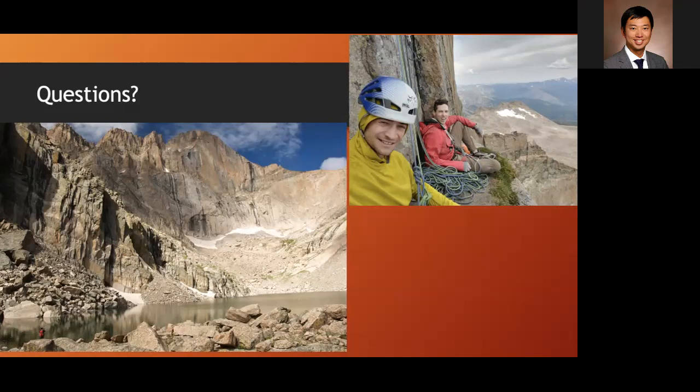And then great talk, Bobby, by the way. Really interesting cases and really relevant use of ultrasound for them. I think the one other thing I'll highlight is that all these cases showed the value of doing serial exams. Even doing a daily exam on basically almost all ICU patients can potentially pick up things that change. And especially if you've been doing the same exam over and over on someone, you notice small things that change that really help you in the management. So great work on that aspect as well.